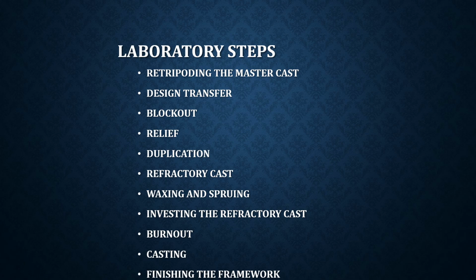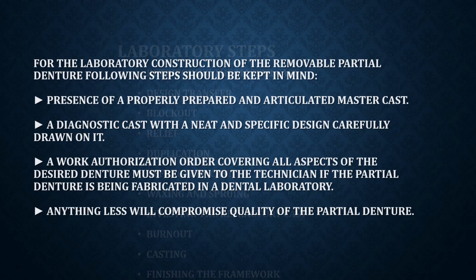After we take a primary impression, we pour a cast, we do framework designing, then we do the mouth preparation, and then we take a final impression. That final impression we send to the lab, right? After that, these procedures begin.